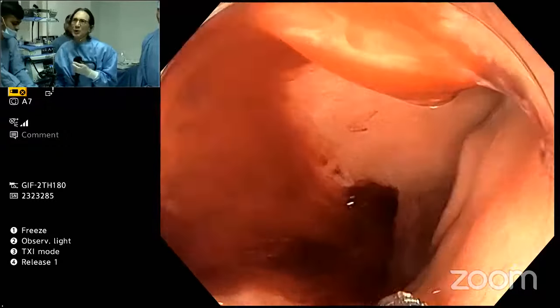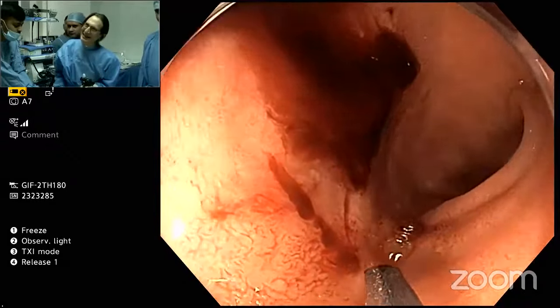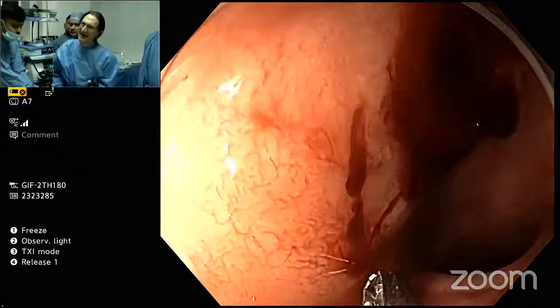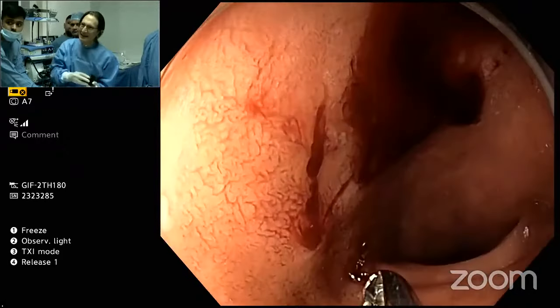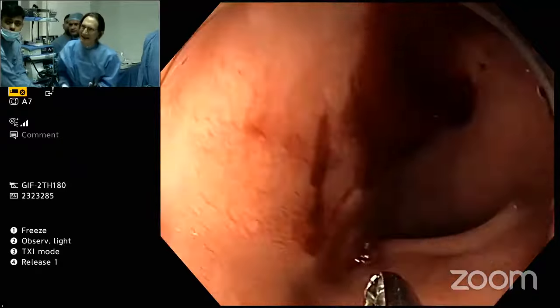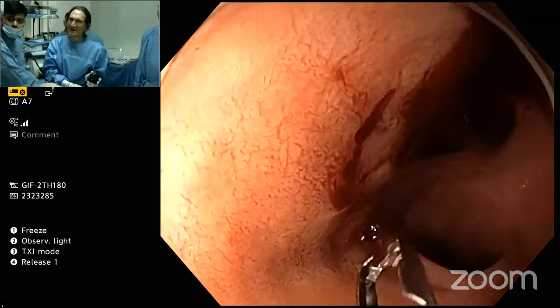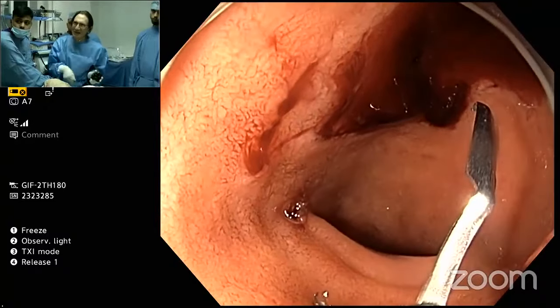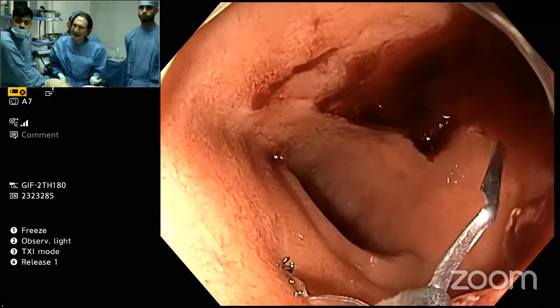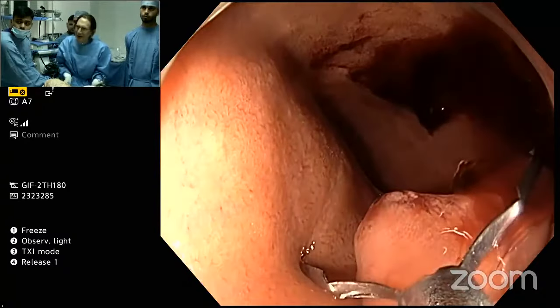So the best way to do this is if I can get my assistant to help turn. He'll be cursing me in a moment, but I'm going to try to turn like this, okay? And then you hold it, turn, please. All right, let me see if I can do this. Sometimes it works and sometimes it doesn't. Okay, open the clip now. And then we want to get it as flat as possible. The reason is it's coming out at 6 o'clock. It would have been really hard to do it the other way. And maybe it'll work. And now hold that.